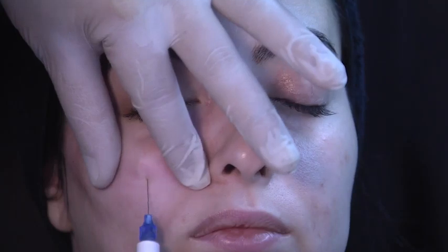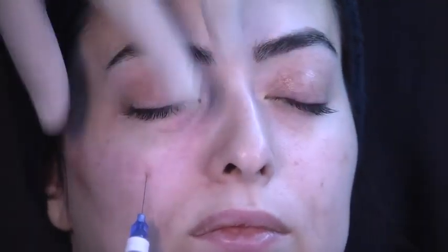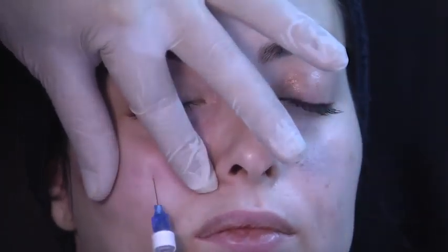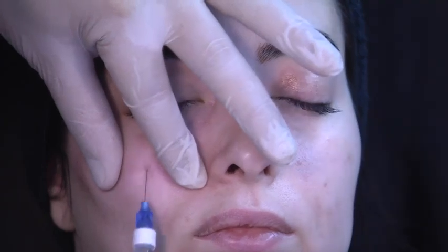Yeah. Okay? This is not the issue for this event, and I do a lot of things in my clinic, but when we finish, I want to talk to you, my friend. It will be his personal recommendation. I'm not allowed to talk about other things here. Actually, you don't see the policeman that I have behind me. Galderma has contracted a policeman because they know that I'm tough. So okay, you're putting boluses here just to do the tear trough the classical way? Yes, correct.